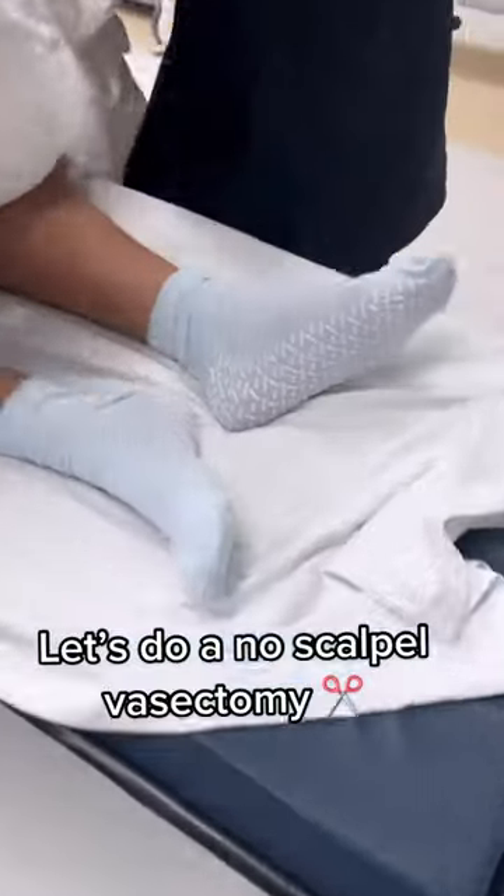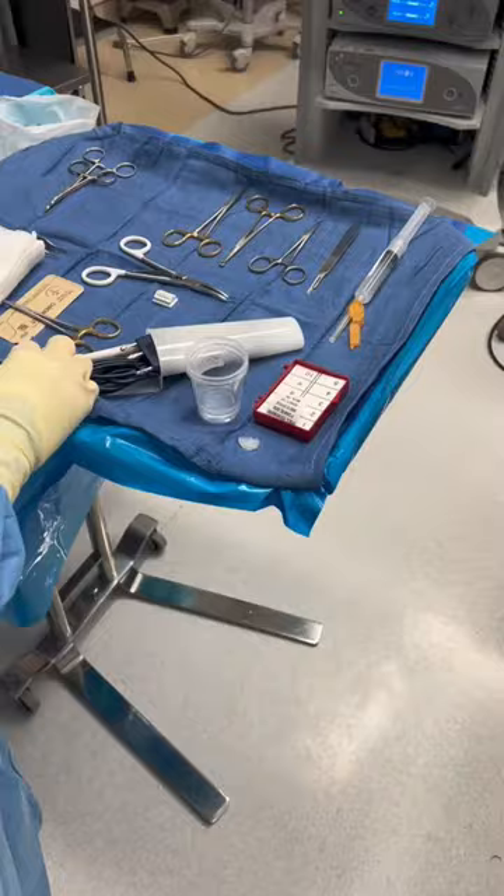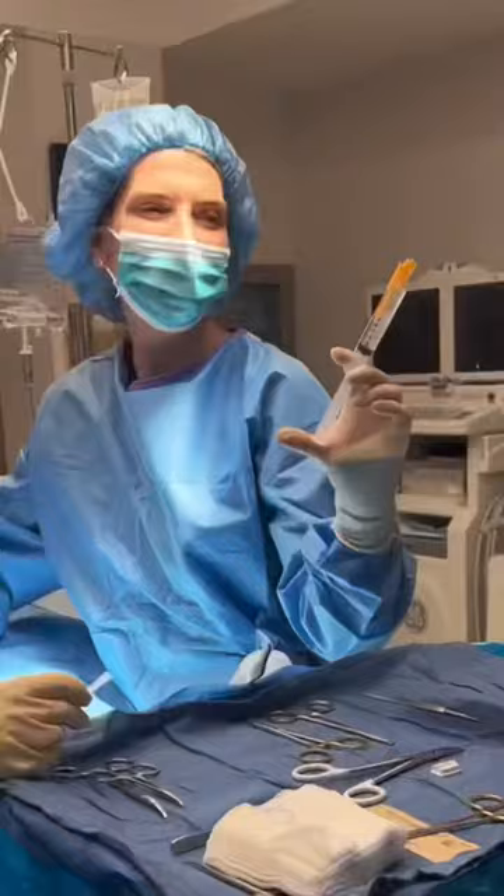Hey guys, today I'm going to show you how I do a no-scalpel vasectomy, and today I have three on my schedule. Here is a quick shot of the setup and our nurse Christina, and here I am going in with the local.